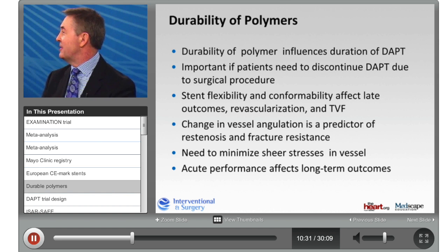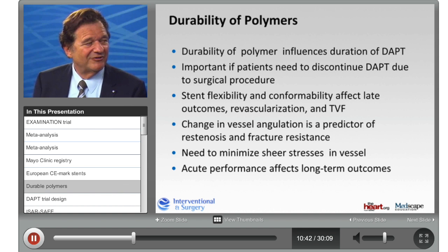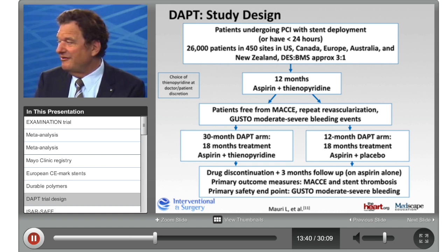And you have this whole issue of, I would feel better if I have the kind of reassurance that, just in case you have to stop the antiplatelet therapy, it's not a big catastrophe. Yeah, exactly. But we need this reassurance. It's a much broader view that we have now, I think, than previously. Yeah, but after all, the conformance of the stent will end up in efficacy and safety. So these parameters are still valid.